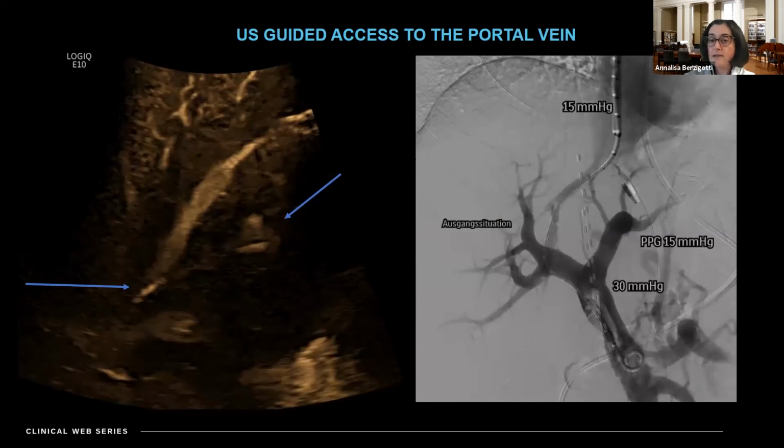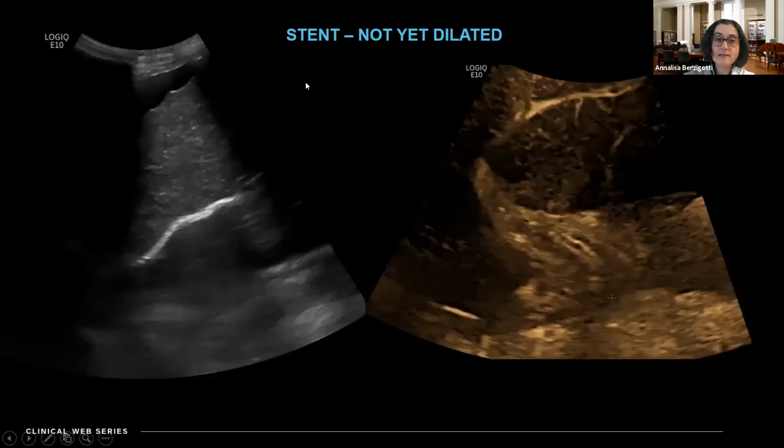On the right side, you see the angiography image and the measurement of pressure in this patient, which of course was high as expected due to this severe portal hypertension. You can also see in the portal vein the aspect of the thrombus, that is this lack of complete replenishment. And so we could guide the puncture much better. Furthermore, you can really follow in real time what is happening also with the different material you put in.